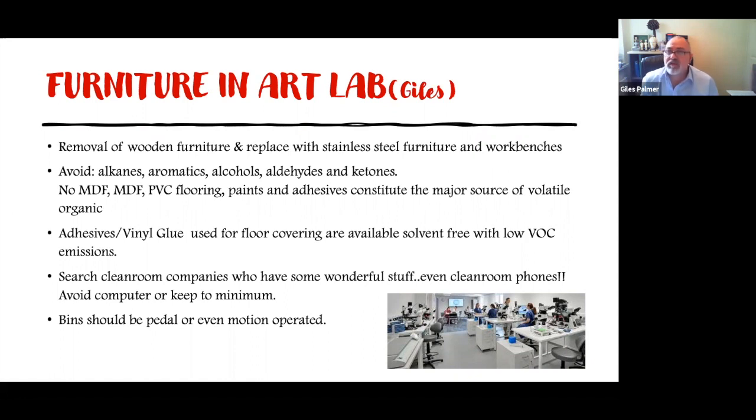like workbenches, if you like. You can go to clean room companies; they've got some fantastic stuff there. Or you can go to a local supplier that deals with stainless steel manufacture and make some purpose-built cupboards, if you like. I'd avoid having closed cupboards or a lot of shelves. For workbenches, you can use, as in your walls, material which doesn't give off VOCs and which is non-porous.